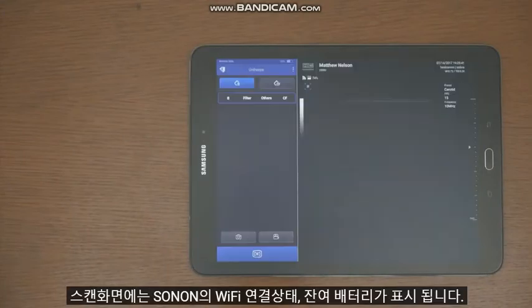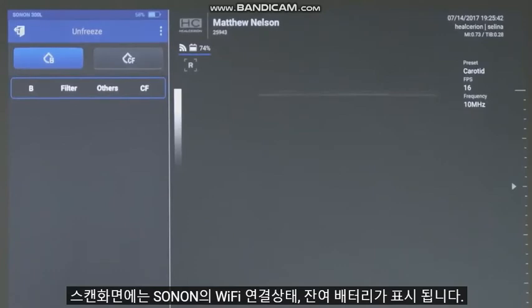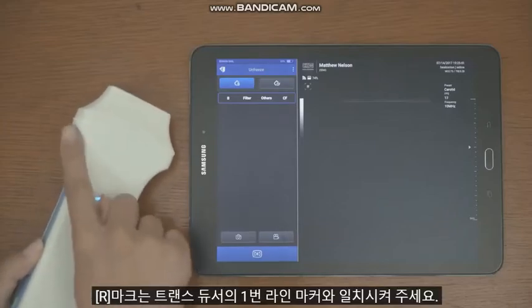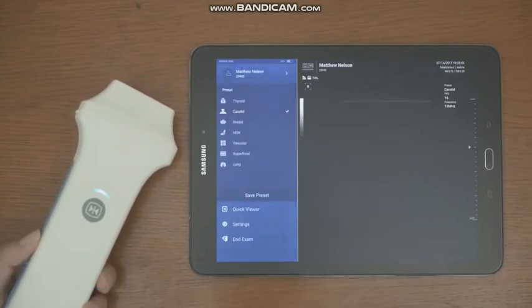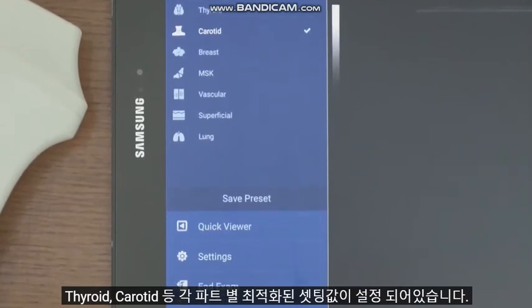The scan screen displays the connection status of the Wi-Fi connection and remaining battery status. Identify the patient's name and ID, and match the R mark to the transducer's line 1 marker. Before starting to scan, set the preset from the menu button. Thyroid, carotid, etc. are preset for each body part.